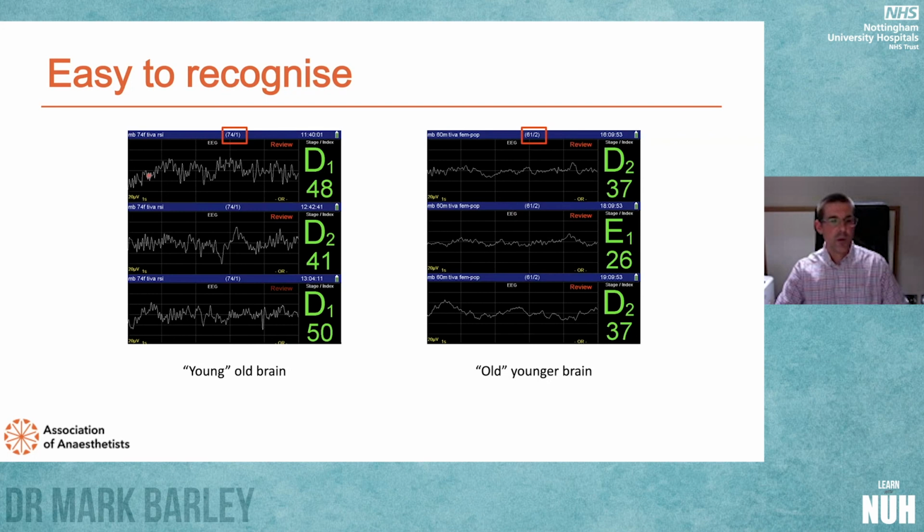Here, a 74-year-old: look at the size of these alpha oscillations on this EEG as this patient undergoes laparotomy. Here's a 60-year-old having vascular surgery, and look how flat that line is. Importantly, these are both at the same calibration. Our machine is indicating this is a satisfactory depth of hypnosis. Yes, it is, but the alpha oscillations are very small. I'd expect more problems from this patient than from this one. I suspect this patient will wake up very nicely with their young, older brain.